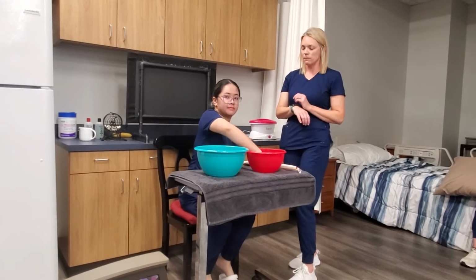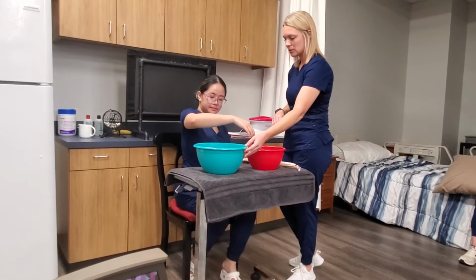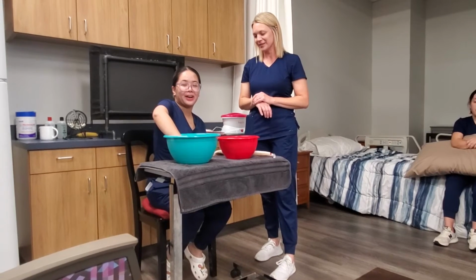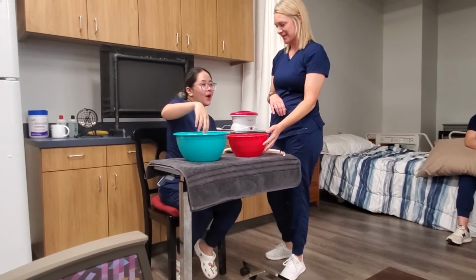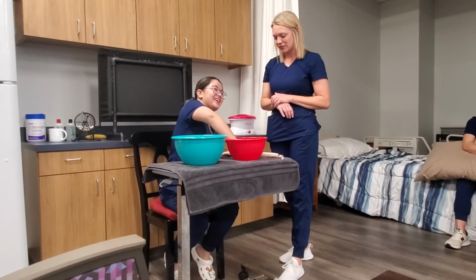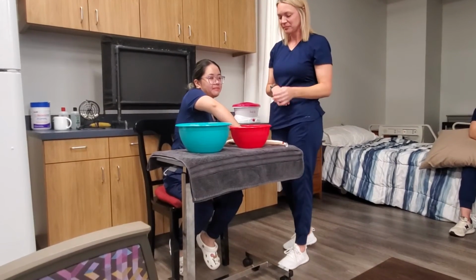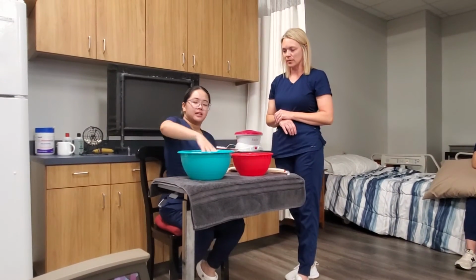Okay, so we're at 4 minutes. You've done a great job. How are you feeling? It's a little warm. It is warm. Okay, this one's gonna feel cooler if you'll go in and gently squeeze. And then we'll be at 4 minutes. Okay, you've done a great 4 minutes. I know it's gonna feel different. So how's your hand feeling? That's nice. The warm's better on it. Uh-huh. Okay. Alright, you'll go ahead and go back after 4 minutes.